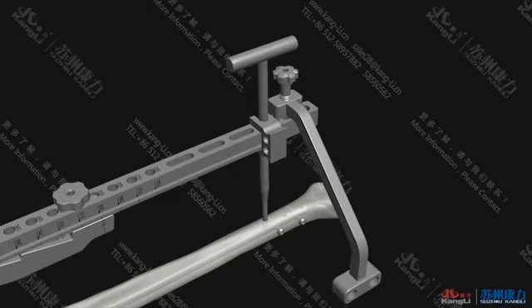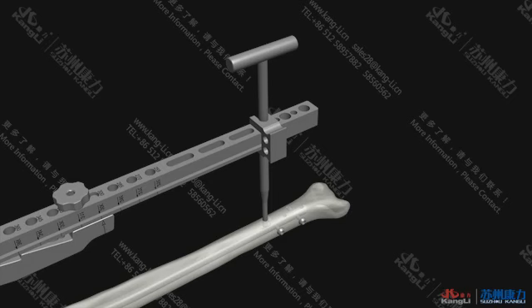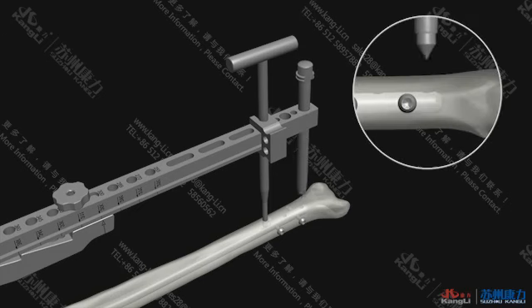The third and fourth 4.5 locking screws could be placed at the front or rear of the nail of KTO Tibial intramedullary nailing system according to the requirements by the type of the fracture. The operation should be performed as the following. Insert the soft tissue separator and outer sleeve at the front and rear position of the distal end of the guide bar. After a 0.5 cm long incision is made right under, continue inserting the soft tissue separator and outer sleeve until bone cortex is reached. Remove the soft tissue separator. Insert 4.0 inner sleeve and 4.0 pin to drill.